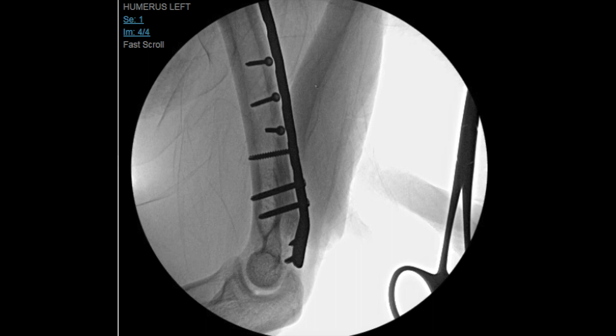So we gave the patient two options: he could be casted, or he could have surgery, and he opted for surgical fixation of the fracture. In addition, we did get a preoperative CT scan to demonstrate the full extent of the fracture and make sure that it didn't go into the joint.